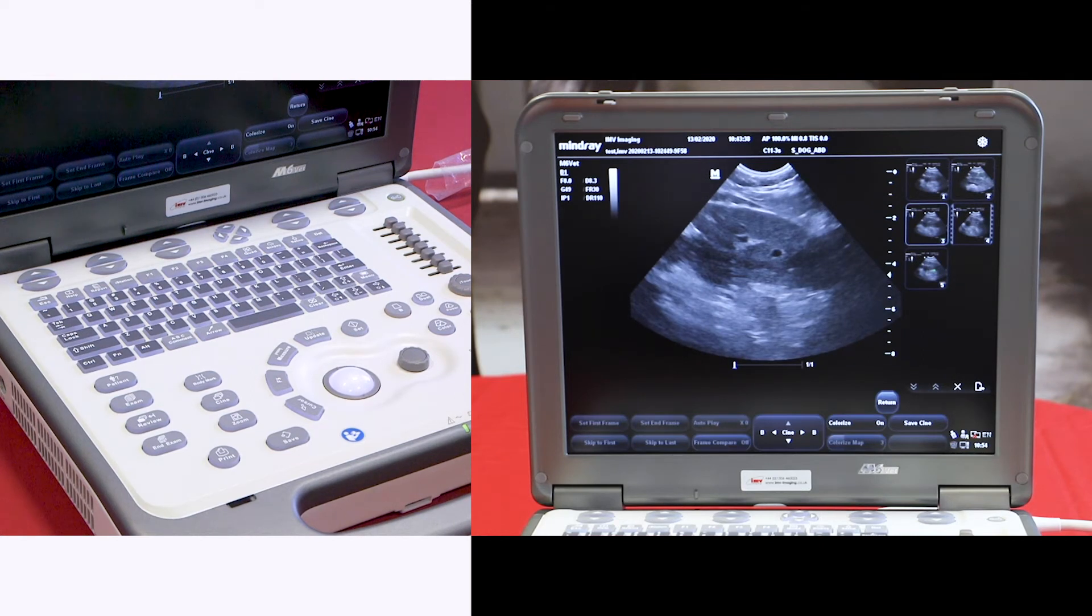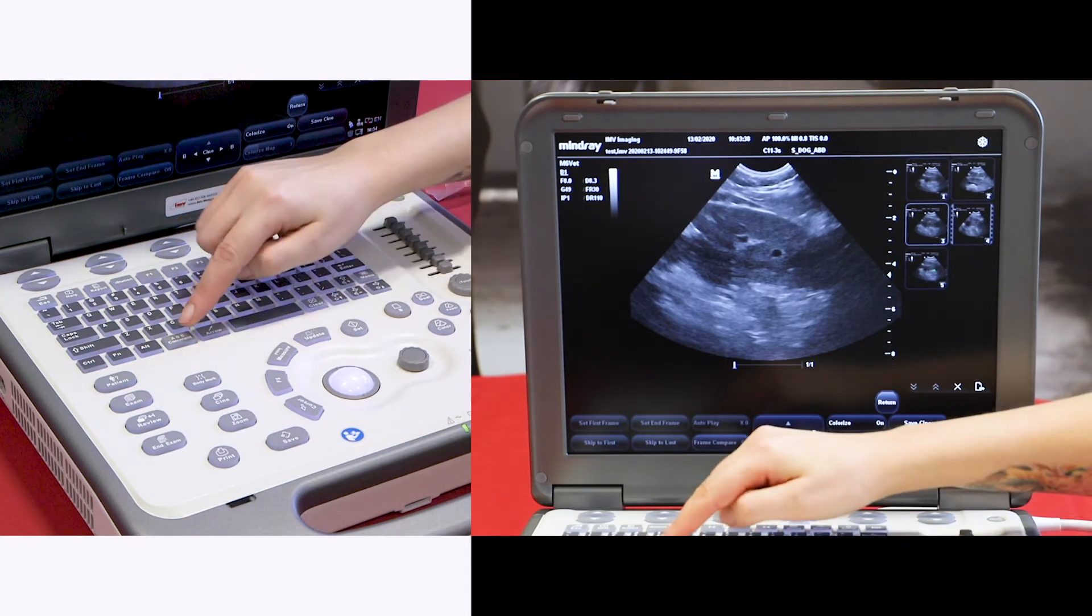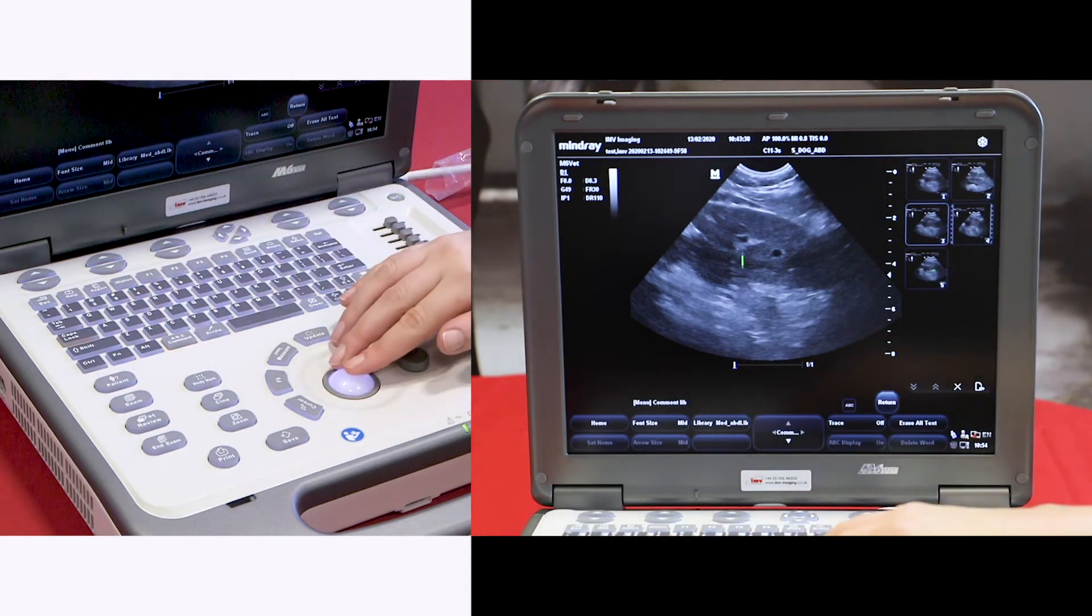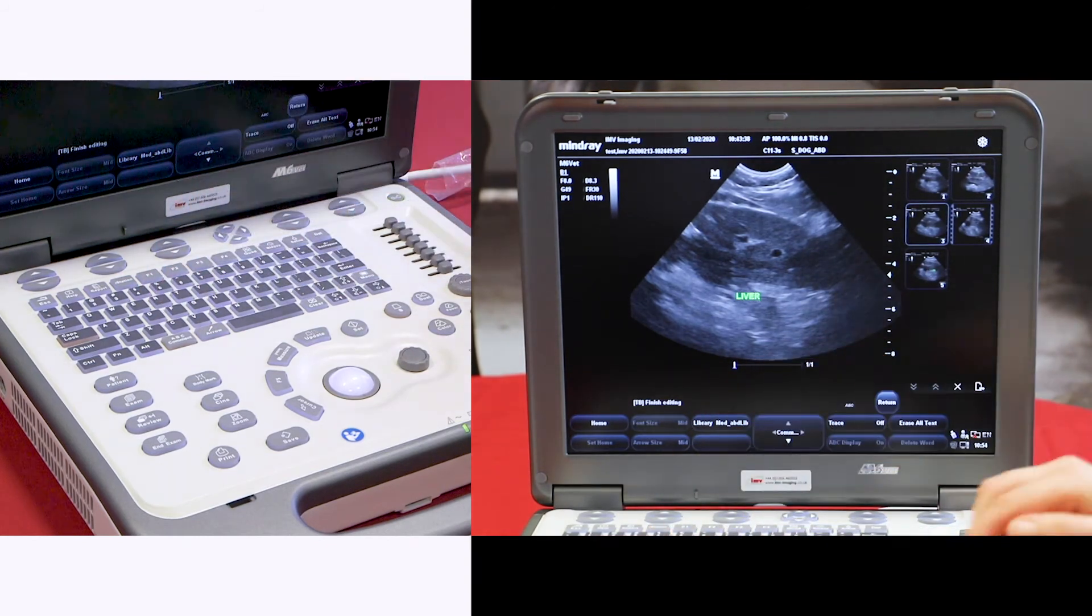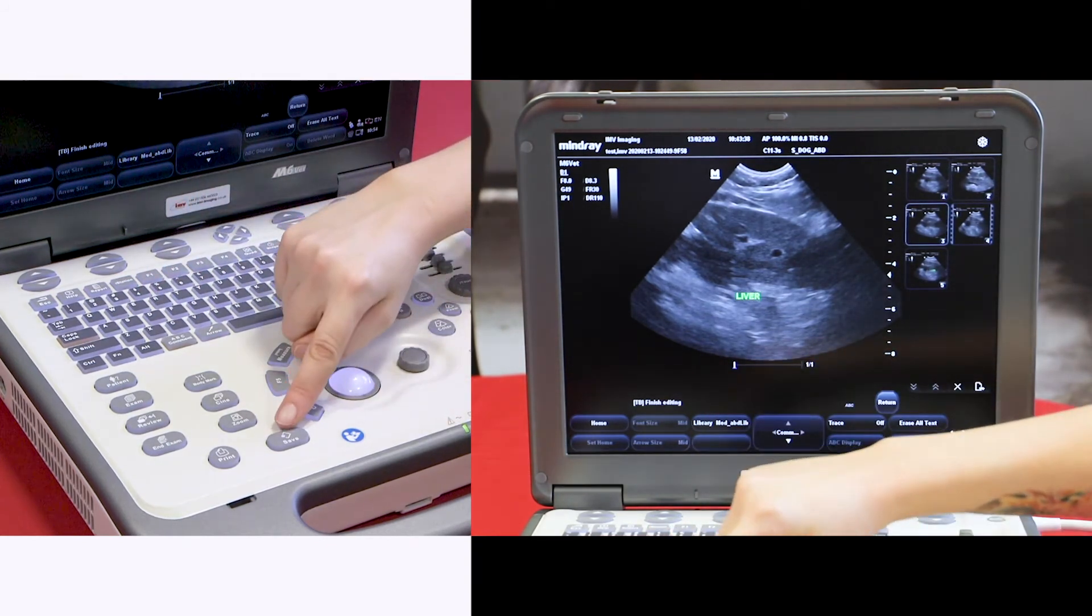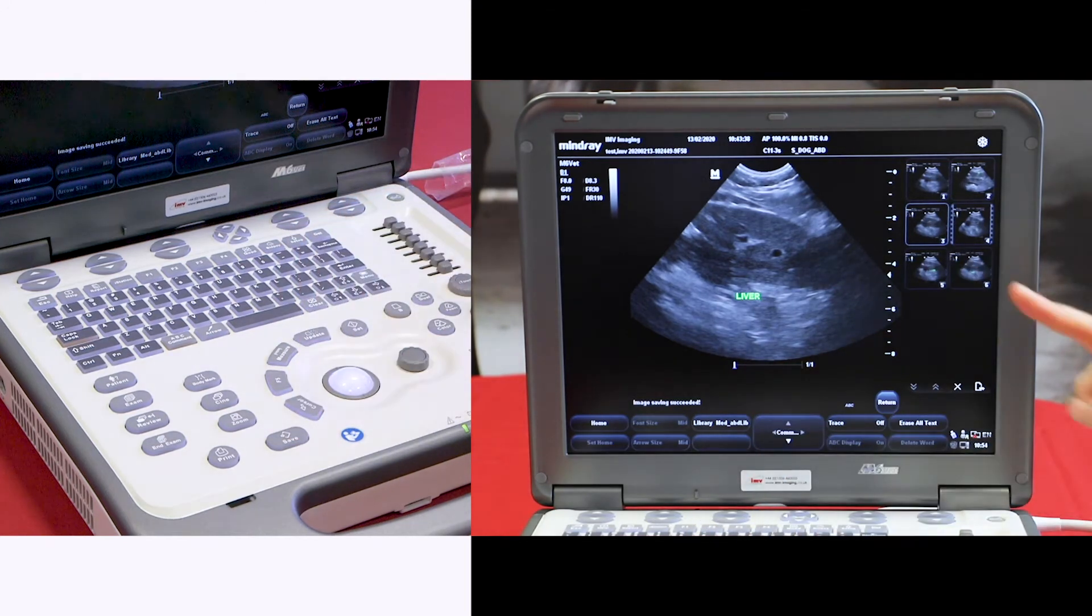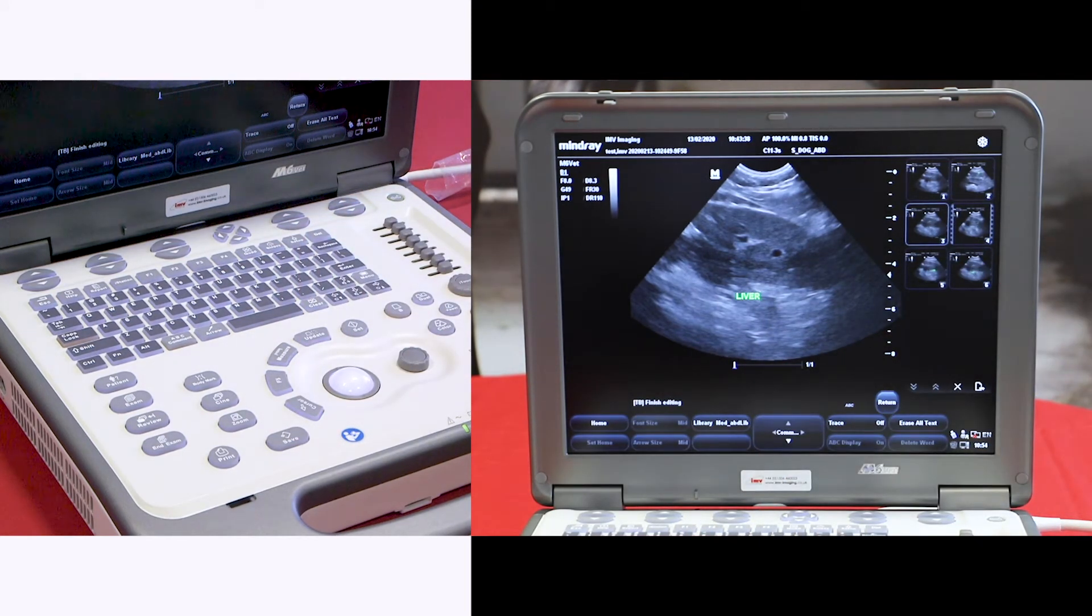If at this point you realize you want to make a measurement or add a comment, you still can. Press comment, add your annotation, and then save. It will save as an extra image, and the original is still saved.